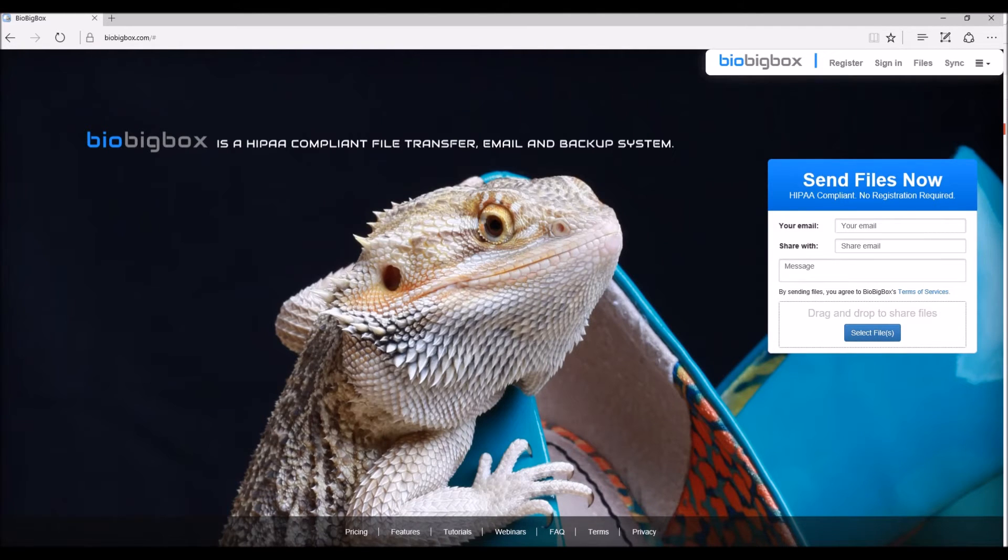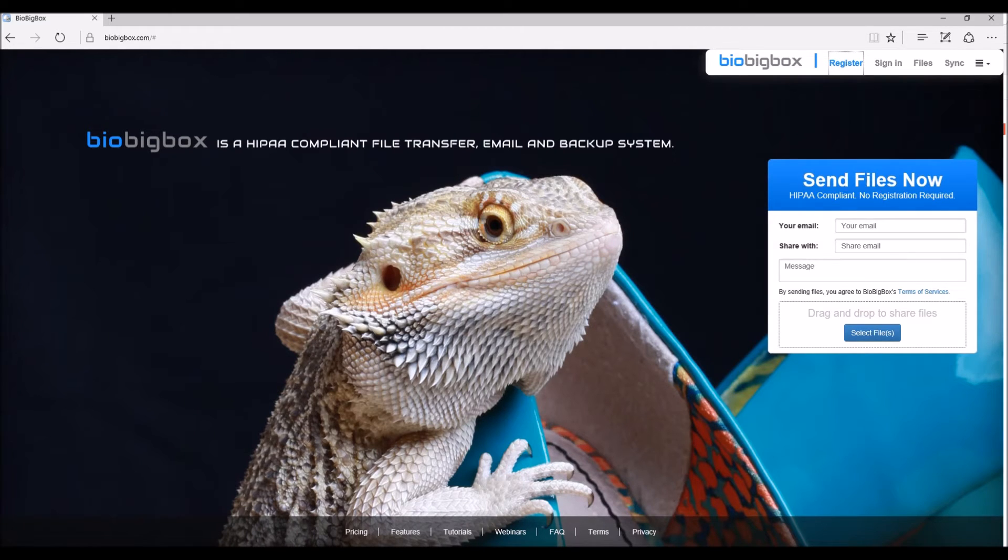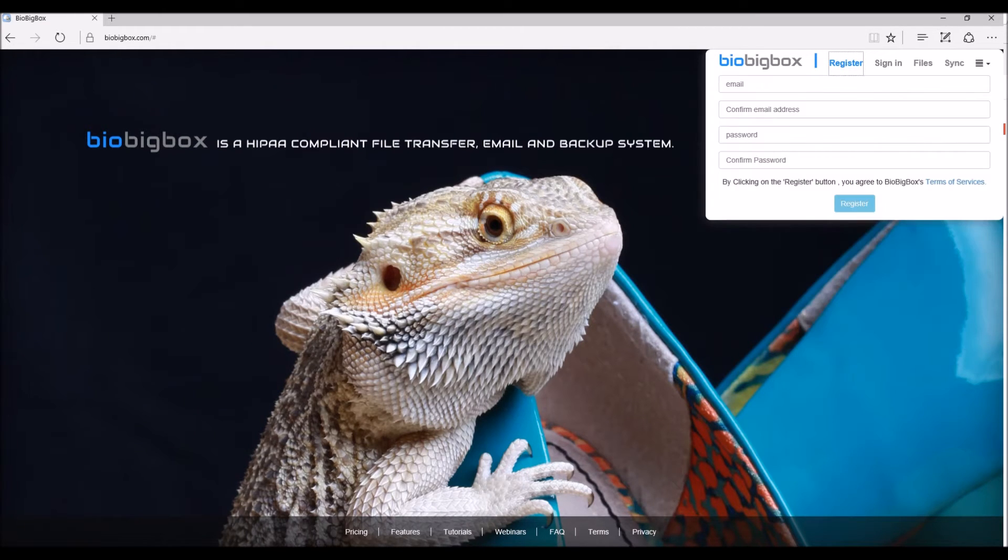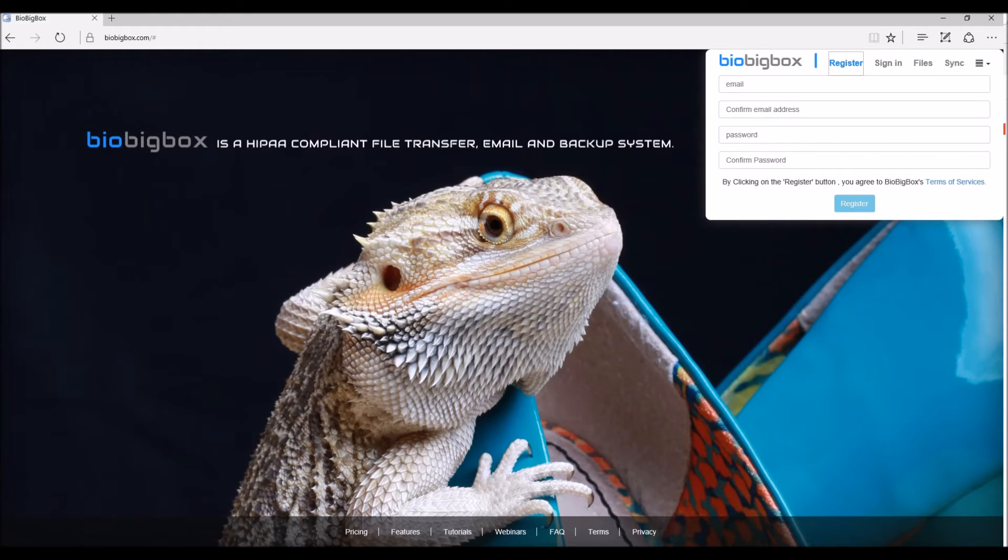Before doing anything, you want to register and create a BioBigBox account, which you're going to need on the Blue Sky plan software. Registration is super simple. You put in your email address twice, set a password and enter it twice, and you then have a BioBigBox account.